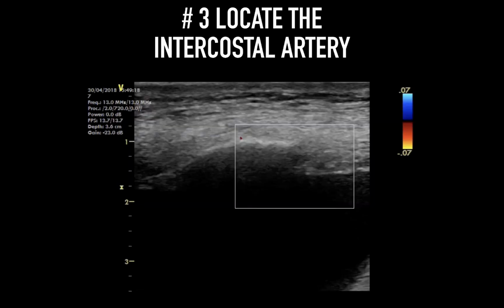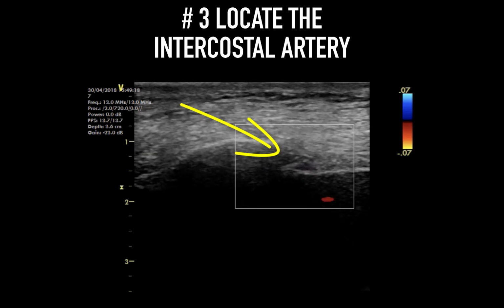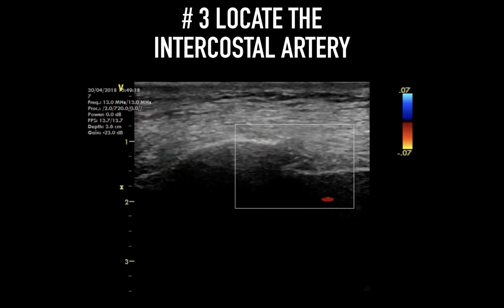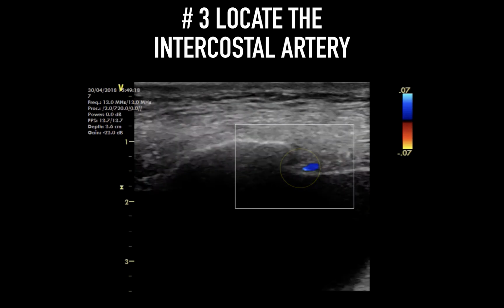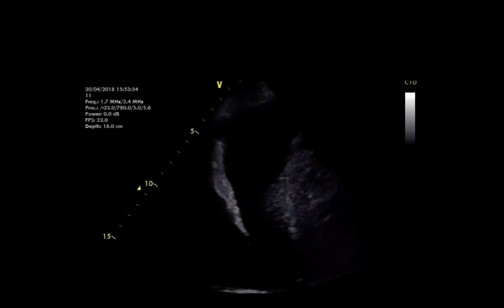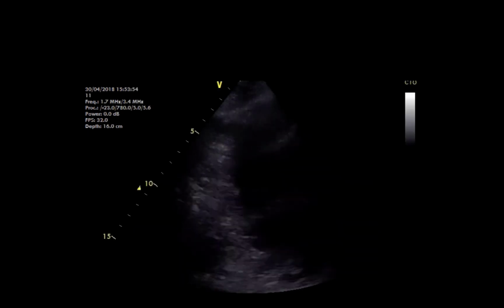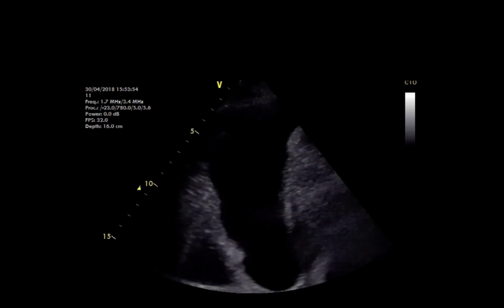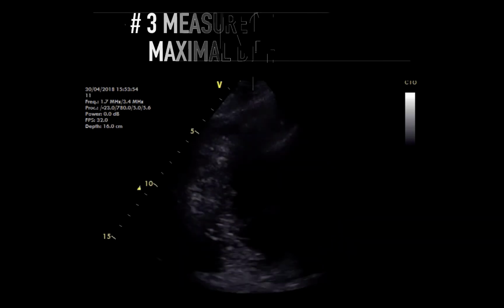In this case, we can actually see the color boxes placed over the inferior portion of the rib. This rib is in short axis, as we see the end on the rib. Below that rib is the neurovascular bundle. We can see here the vessel as it pulsates. Another use of these ultrasound-based techniques is to be able to locate a safe place to proceed with the procedure, and also to identify and measure the appropriate depth at which you will insert your needle.